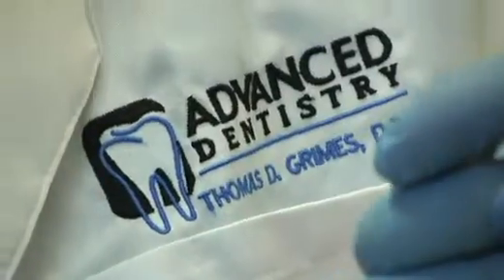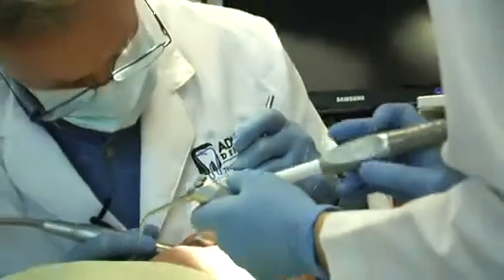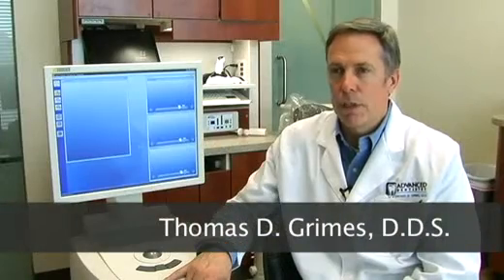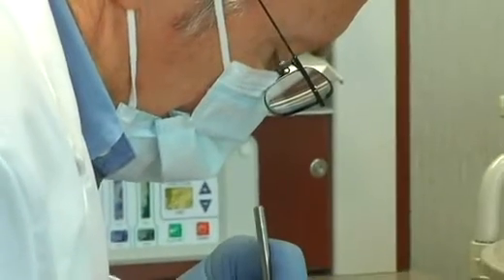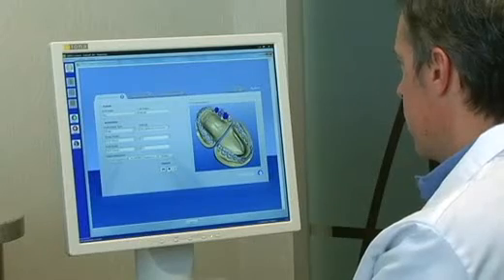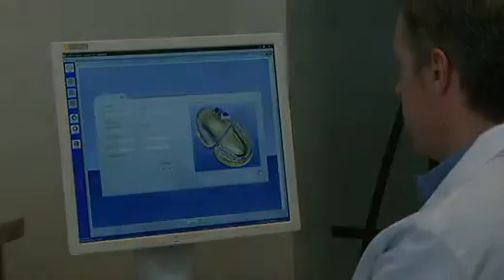My name's Thomas Grimes. I've been practicing dentistry for 20 years in Matthews, North Carolina. I've been using CEREC technology for 14 years. Today we will be preparing a bridge for my patient from tooth number 13 to tooth number 15. We will be using the CEREC Connect technology to fabricate a zirconium bridge.